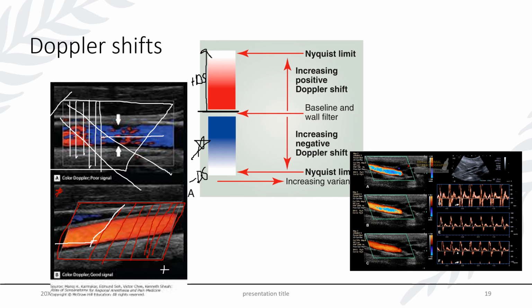Now, a common misunderstanding is that our equipment naturally just applies red to arteries and blue to veins, and that's not the case at all. It's under the operator's control to make arteries look red and veins look blue, and we have to steer our Doppler angles, as well as invert or adjust our color scale to ensure that we can represent our arteries with red, our veins with blue, and assess exactly how blood flow is moving.